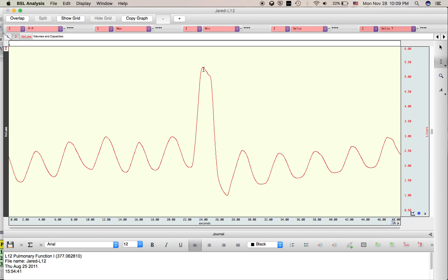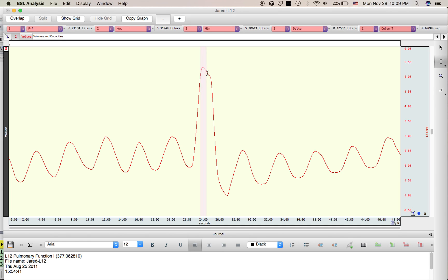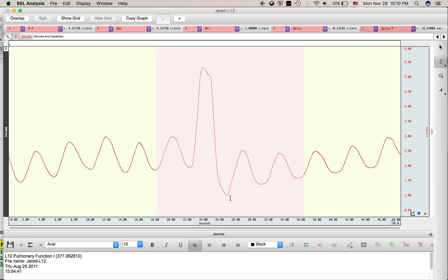To determine the vital capacity, we look at the deepest inhale and the deepest exhale and use the peak-to-peak tool — you can see it's roughly 4.32 liters. If I highlight anything more than that, I get the same value because those are the peaks. So as long as I include those values, I'll get the same measurement in the analysis bar.